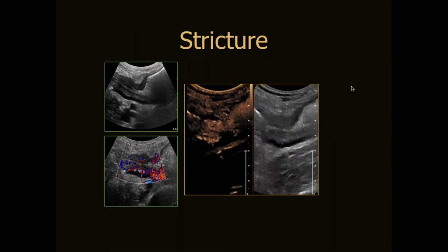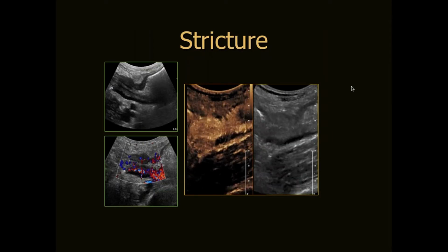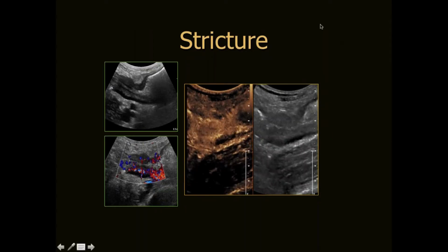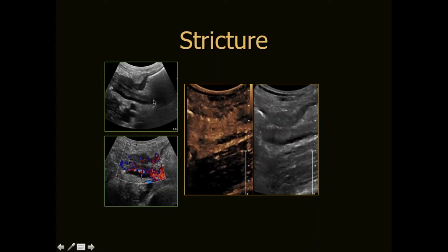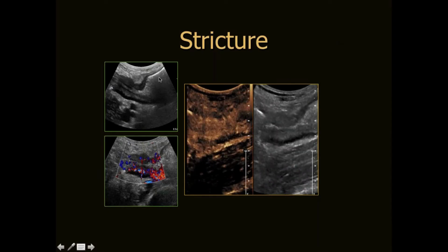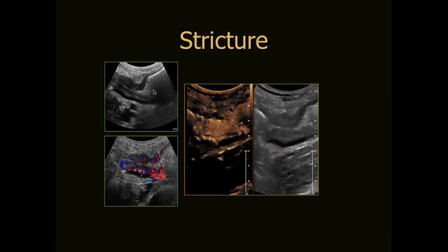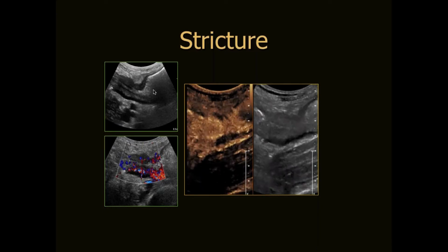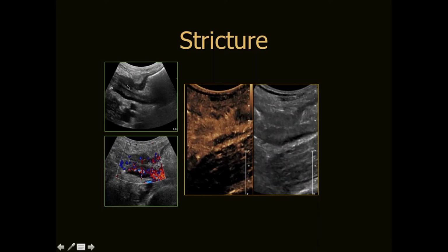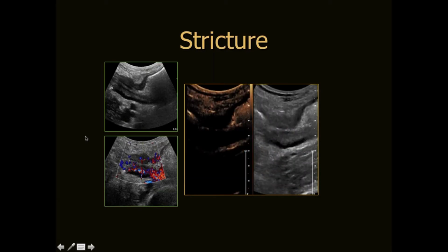And so on the panels shown on this patient, we can see on the left-hand side two panels that show there is a strictured segment here with dilated prestenotic bowel. This is a typical appearance for the dilated prestenotic bowel, where oftentimes there is air at the front of that portion of the bowel, making a distal shadow as we see here. And then we would study this portion of the bowel, looking at the thickness of the bowel wall, looking at the lumen, and then assessing to see if that lumen opens or whether it stays closed.